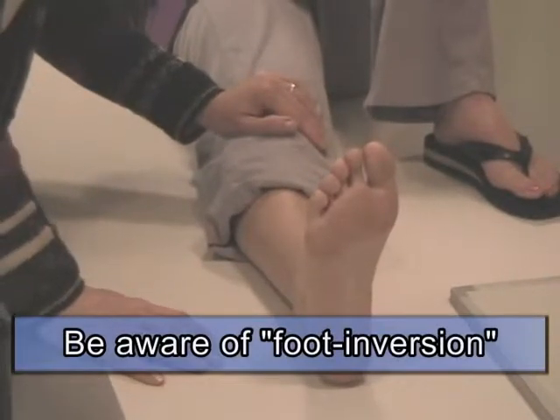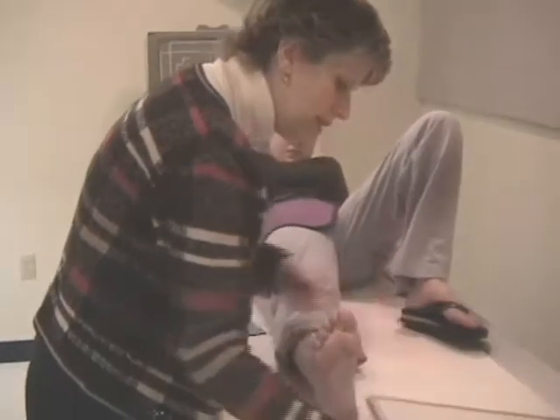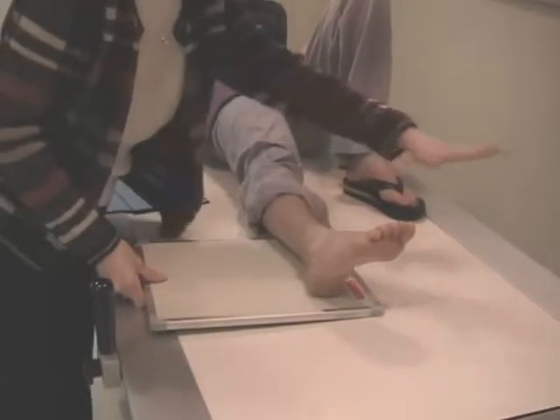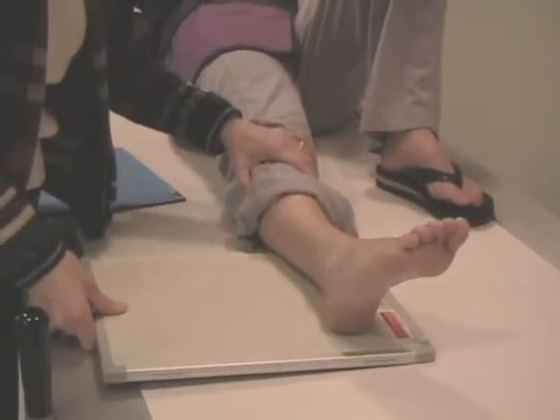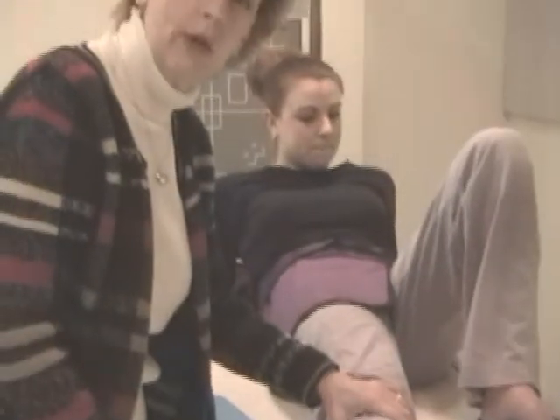Okay? So we're going to recap our positioning. The ID blocker goes to the medial side of the leg. Your internal oblique, so the foot goes off one edge, is approximately a 15-degree obliquity. It's actually called an AP mortis. Its purpose is to open up the mortis joint.